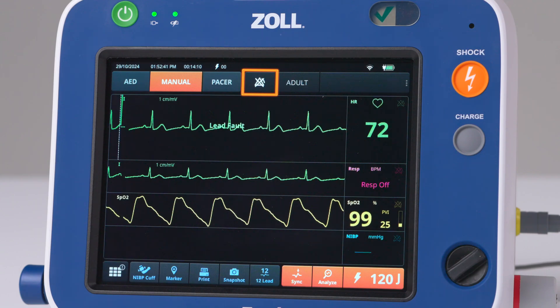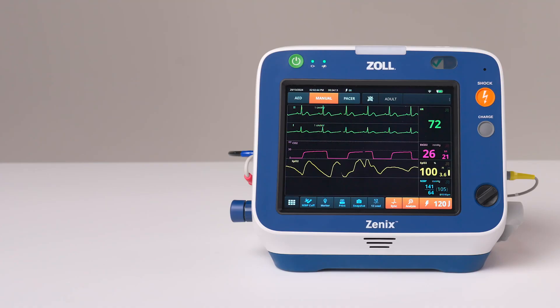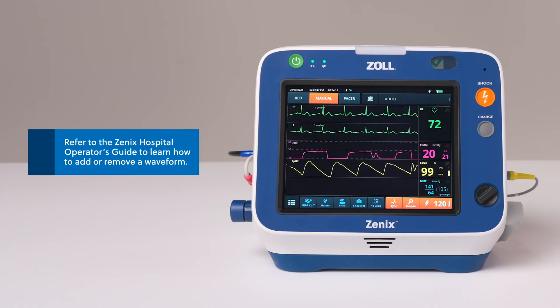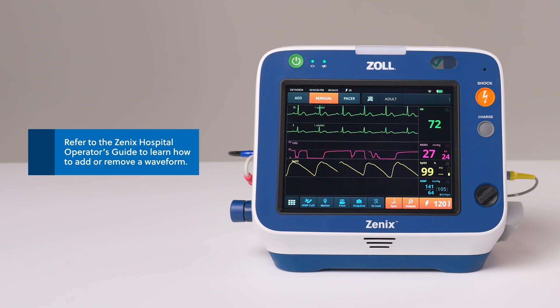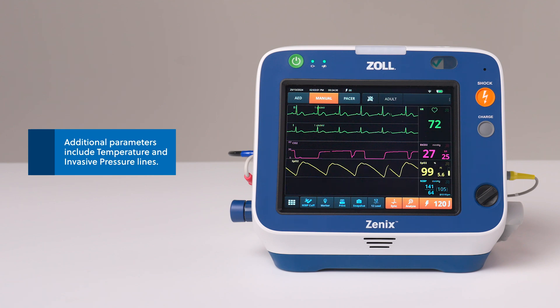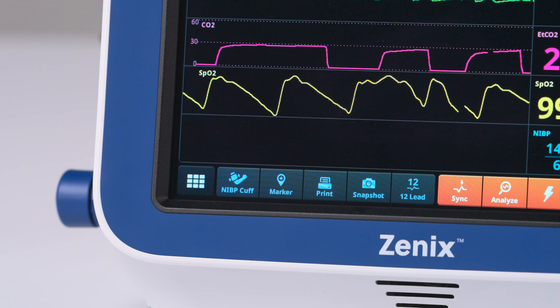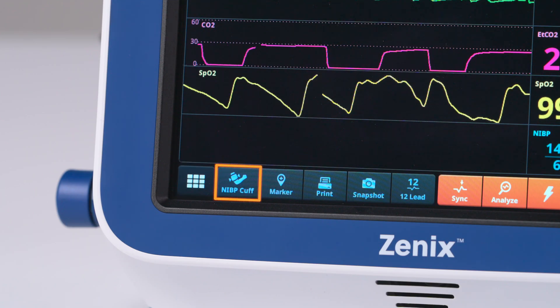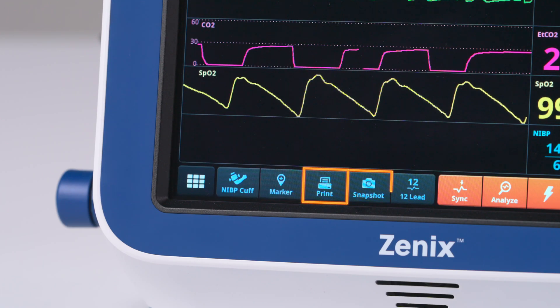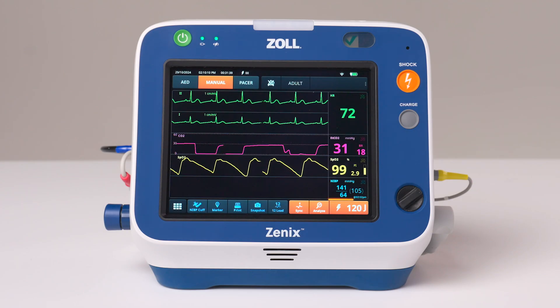The alarm key enables or disables patient alarms or can be used to make alarm setting changes. You can display up to four color waveforms on Xenix. The first waveform at the top of the display window is always an ECG waveform. Numeric data can be displayed for the following parameters: heart rate, SpO2, ETCO2, breath rate, and blood pressure. The action bar contains operator keys to access Xenix functions. You may see keys for menu, NIBP cuff, marker, print, snapshot, 12-lead, sync, and analyze. The action bar also displays the current energy selection.